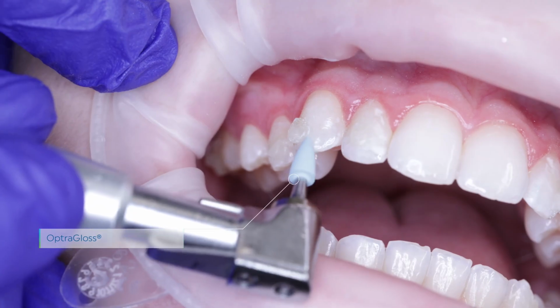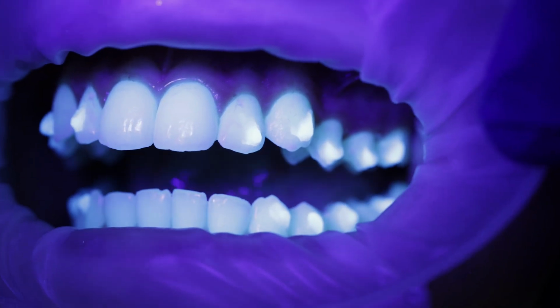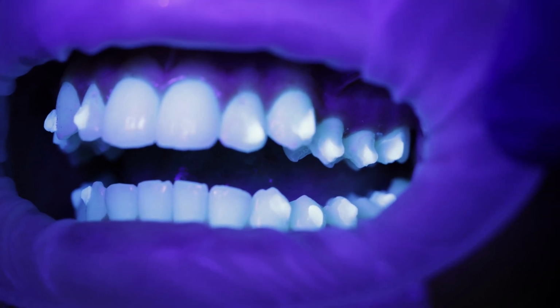We're going to jump to our Optra polishers or Optra gloss. And now I'm going to shine my light. I love utilizing Tetric Evo because of the fact that I have this fluorescence. We're going to shine a black light, and I'll show you where to get it. But you'll have a little black light in your kit, and we're going to shine it in the patient's mouth, and this is what's going to allow us to see where the excess resin is, are there areas maybe where I had excess composite that maybe we did not get off.